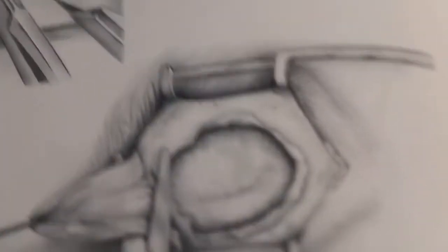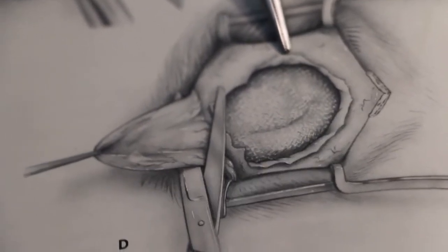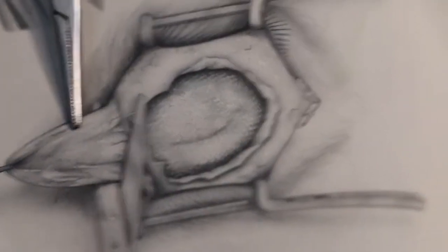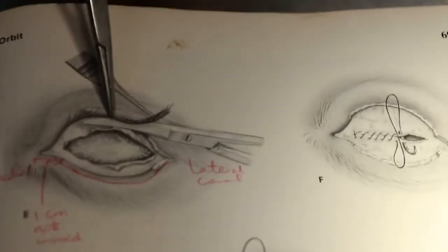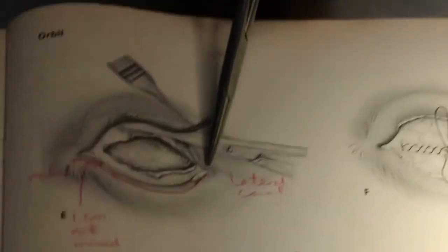Then the next step is to look for the third eyelid, as we call it, and I use electrosurgery to cut it off. Okay, so in the end we were left with this opening where the eyeball used to be, and as you can see from the lateral canthus on this side, I use a scissor to cut the margin.